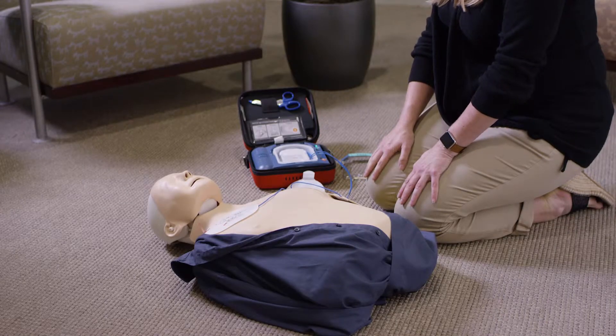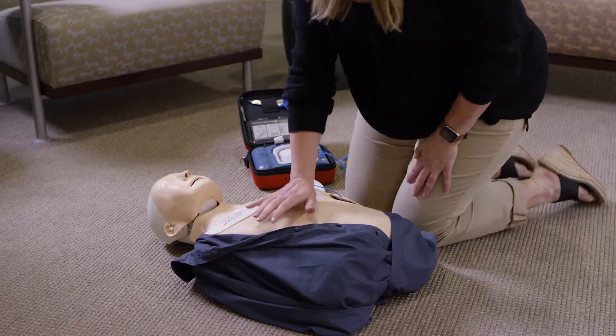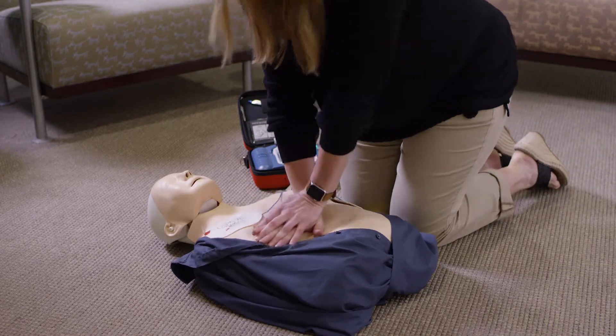Shock not advised. If needed, begin CPR. And it even coaches you through CPR. It's just that easy.